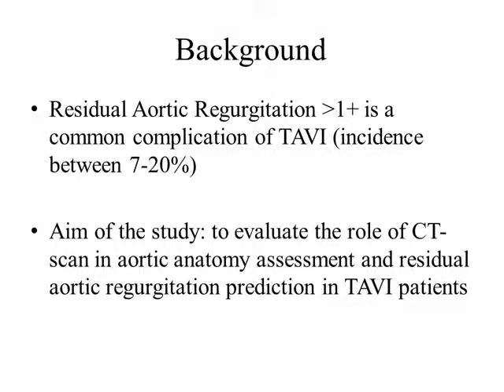We know very well by now that residual aortic regurgitation is a pretty frequent finding after TAVI. So the aim of this study is to evaluate the role of CT scan in the aortic anatomy assessment and in particular in the prediction of residual aortic regurgitation.